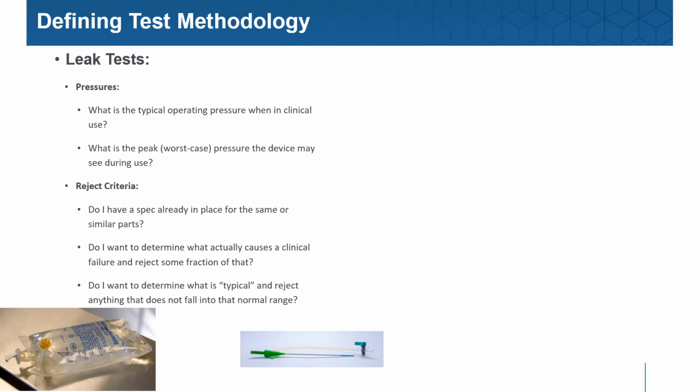So depending, if you've got a single-use medical device, if your volumes are limited and you're always going to have it mated to a single benchtop test instrument, you're not breaking any laws by setting up a delta P spec, doing it following bullet point 3, which is identifying your typical good part, setting X number of standard deviations above and below nominal decay values, and setting that as your, we'll call it your typical or your normal good band, and rejecting anything outside of that.